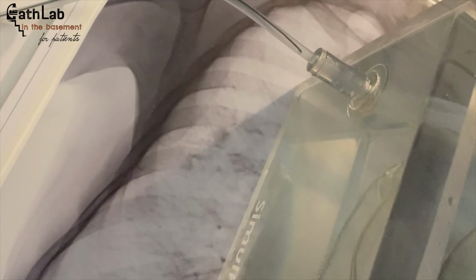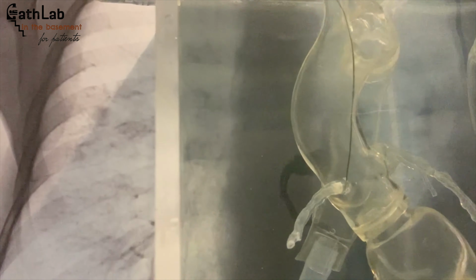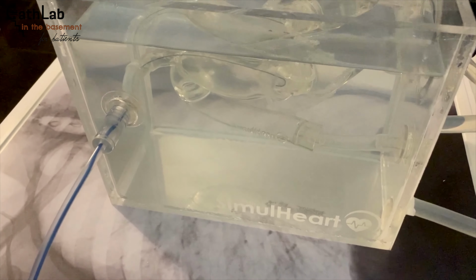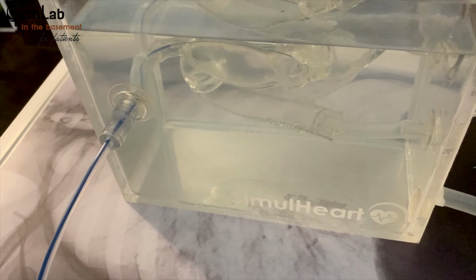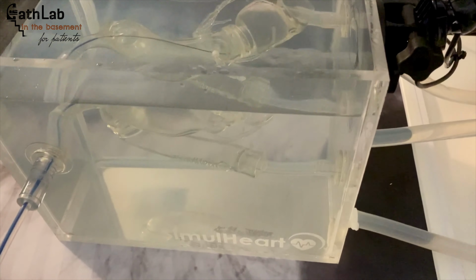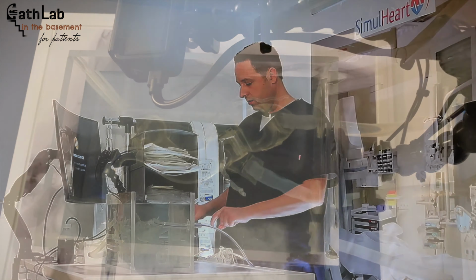The wire is advancing in the arm and will reach the chest, where we have larger arteries, and then we get to the aorta. And the coronary arteries, the arteries that we have to screen to know if there is any coronary artery disease, are connected to the aorta. And the wire comes out. This wire is used to not traumatize the arteries. There is no trauma and there are no punctures in the arteries when we use the catheter.